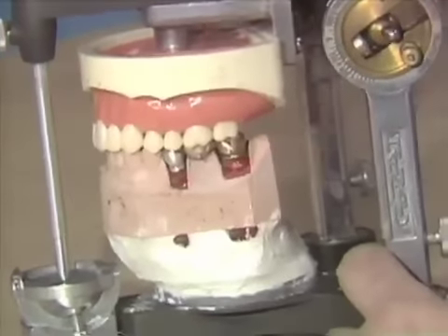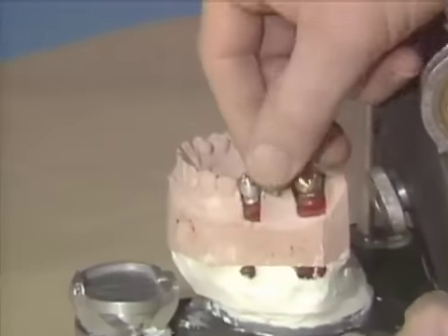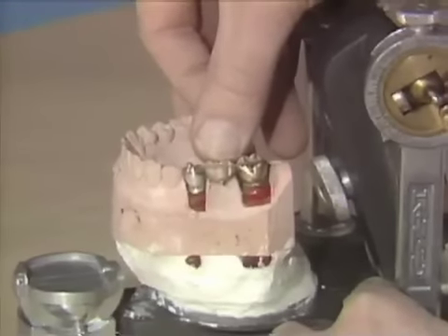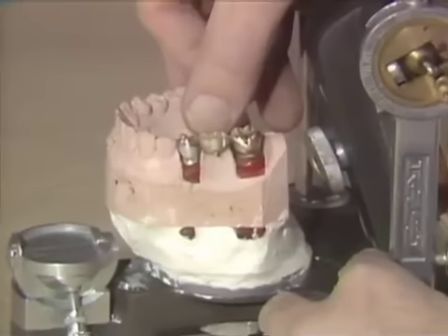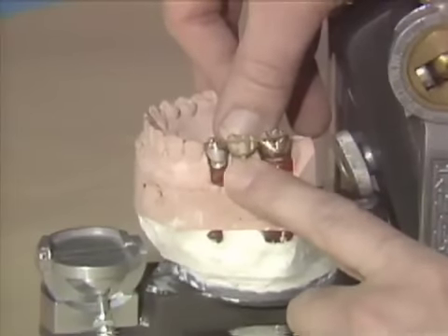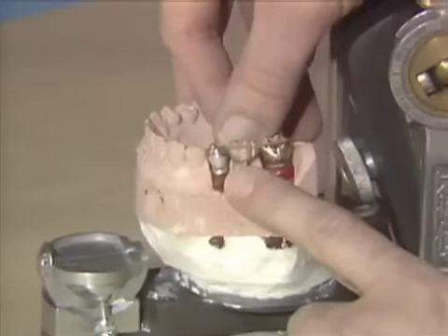If your pontic is loose, if the lugs you did not capture very well and this is rocking, you obviously cannot adjust your occlusion very carefully at this stage. What you will have to do is use some red utility wax down here by the ridge, or sticky wax, get the pontic in its best position, and adjust your occlusion.